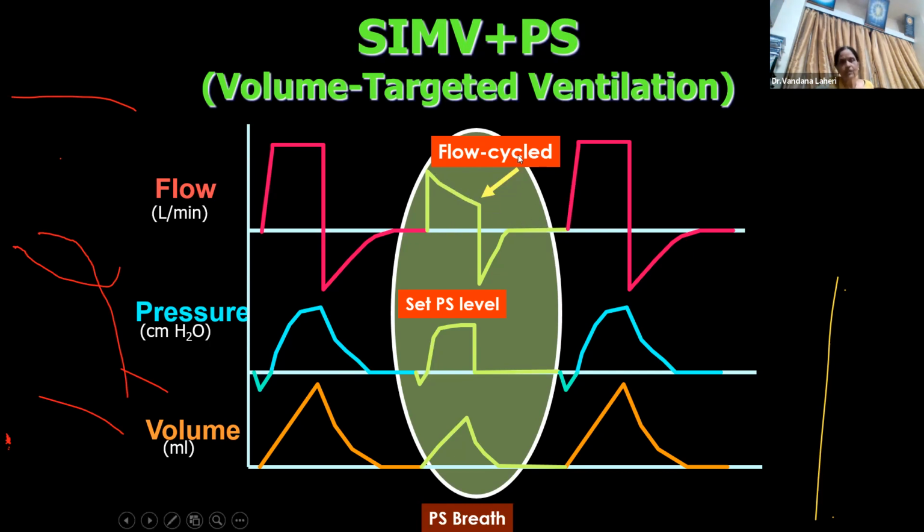So at some point you have to decide how much the flow should fall compared to the original when the cycle will break. Generally ventilators let the cycle break at 25% or 20% of the original flow. Whenever you set the patient on a pressure support mode, you have to set this: at what fall in flow the ventilator should cycle from inspiration to expiration.